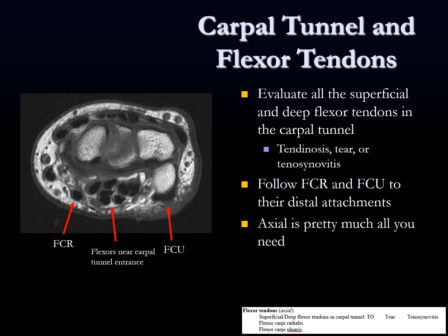Here's the carpal tunnel and flexor tendons. This is an axial T1-weighted image of the wrist. We want to evaluate all the superficial and deep flexor tendons in the carpal tunnel, looking for tendinosis, partial tears, full thickness tears, and tenosynovitis. It's pretty easy to follow the flexor carpi radialis and flexor carpi ulnaris muscles to their attachments. We have deep and superficial tendons, and then we have the median nerve. The reading pattern checklist covers the superficial and deep flexor tendons, the FCR and FCU.